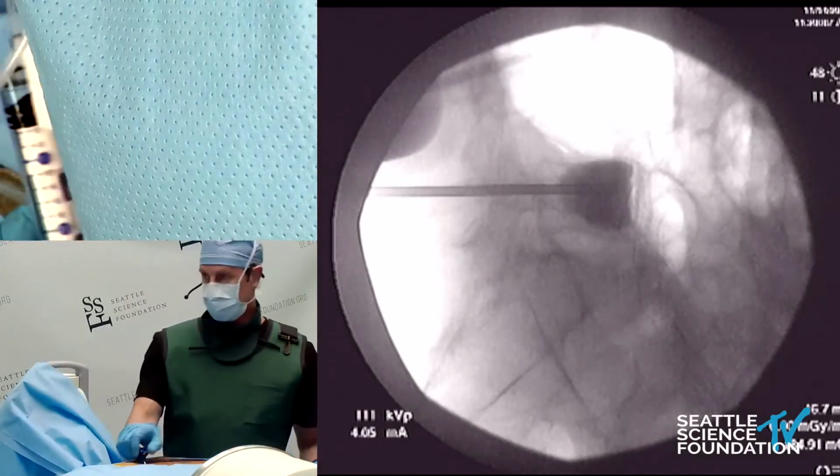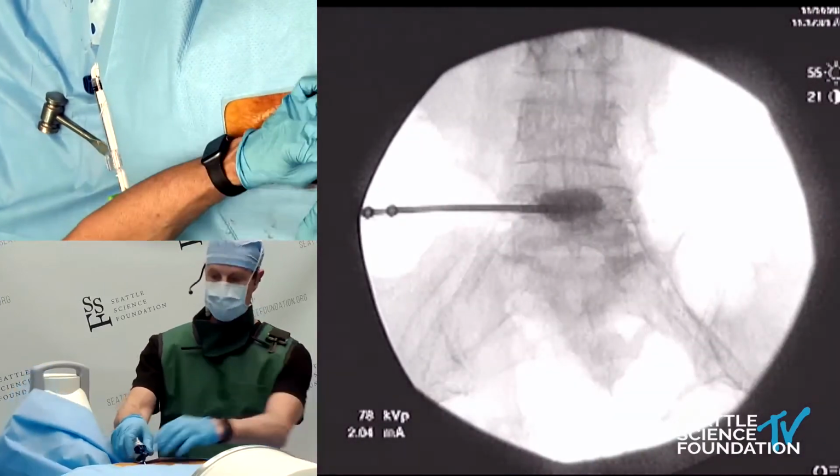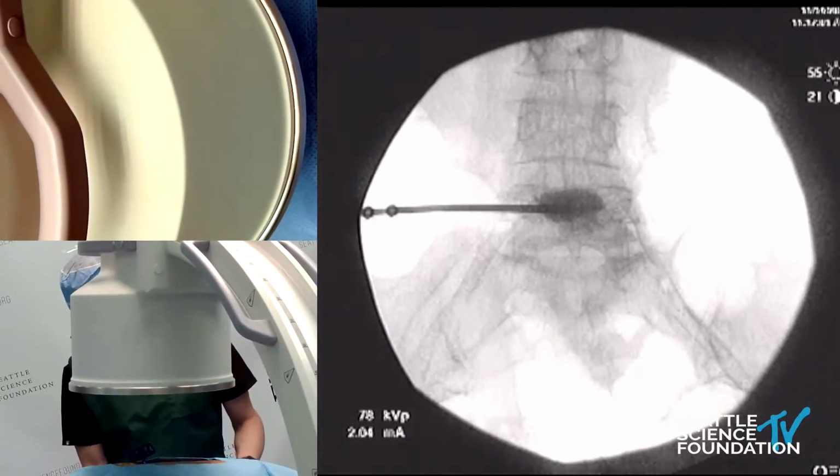And that is nice. Let's take an AP shot of that, and I'll disconnect the bone filler. I'll place the stylet back in, and we'll keep that in to avoid a tail.